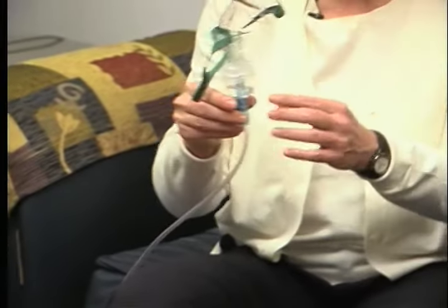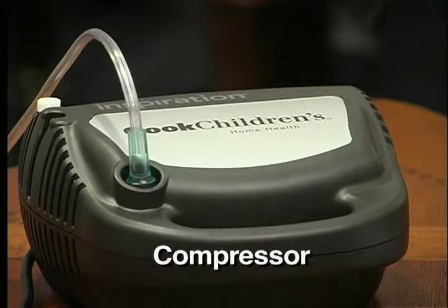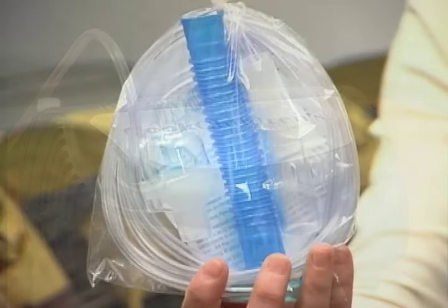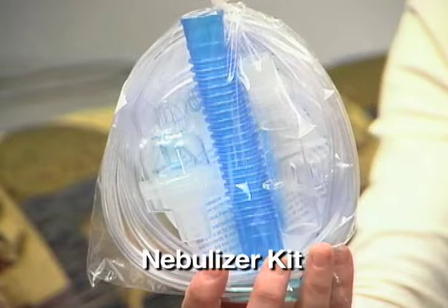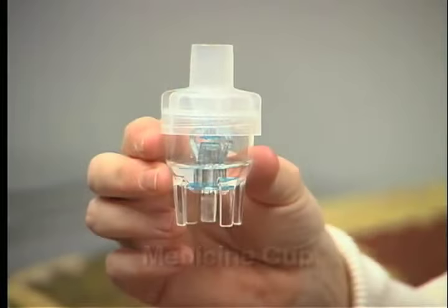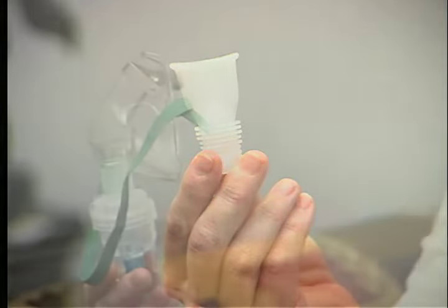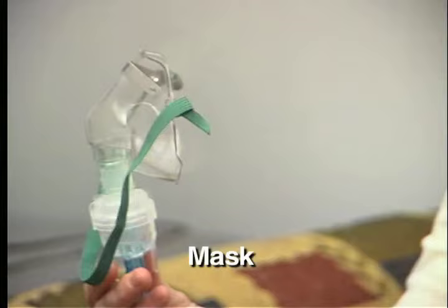The nebulizer works by using a compressor to deliver a stream of gas that goes through the liquid and creates a mist. There are two main parts to a nebulizer system: the compressor, which generates the stream of gas, and the nebulizer kit. Inside the nebulizer kit is the air tubing, the nebulizer cup, a flex tube, a T-piece, and a mouthpiece. And you may also be given a mask.